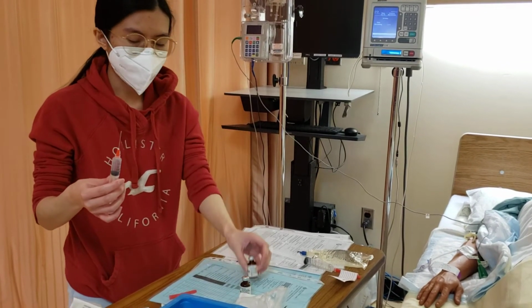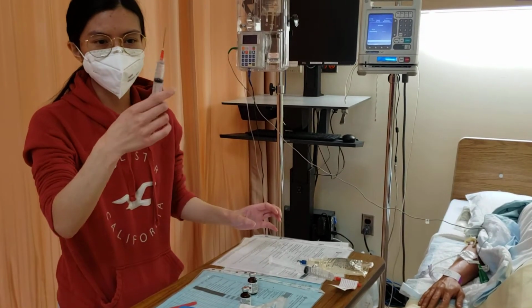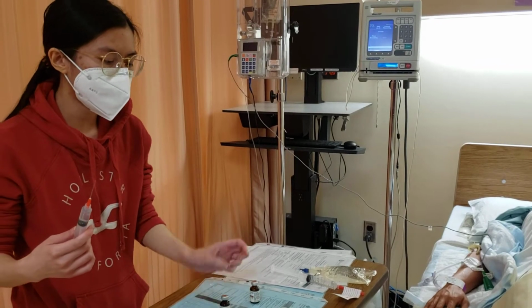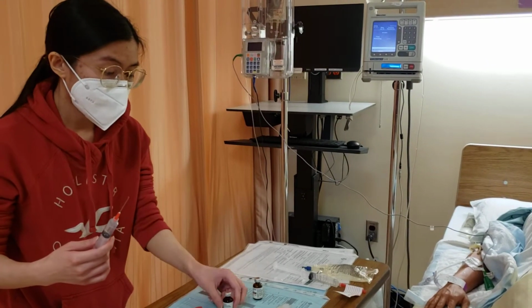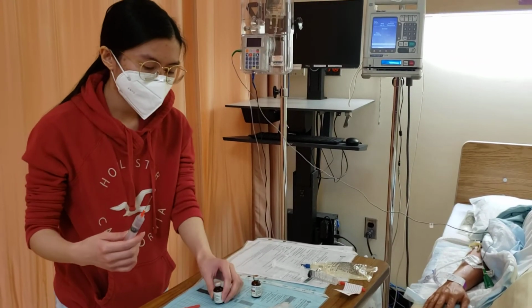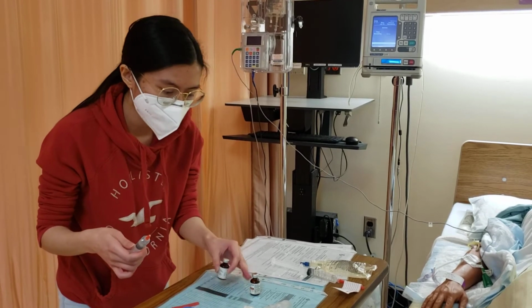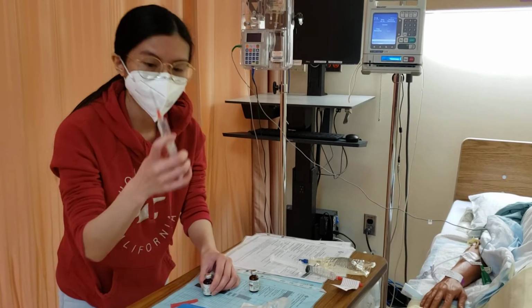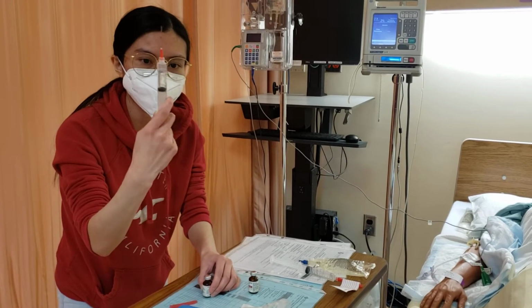I was only able to get about 4.5 here, so I'll make sure that I get the rest from the other vial. This vial has been used multiple times, which is one of the reasons why there's not enough there. But in the real setting, you would get 5 here and 5 on the other vial. So once again, I would need 10 cc.